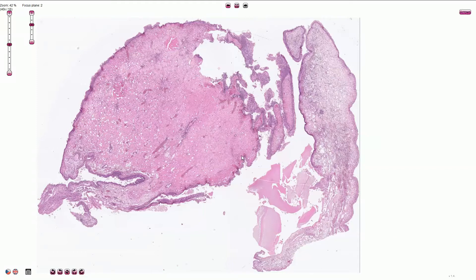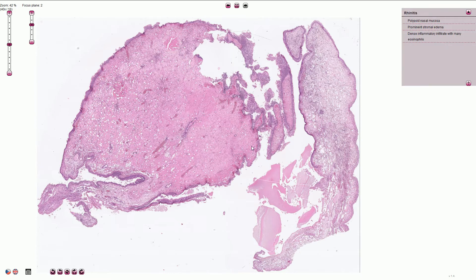Long-term chronic rhinosinusitis can cause nasal polyp development. In this picture we have particles of nasal mucosa which has polypoid features and it is associated with prominent stromal edema and dense inflammatory chronic infiltration.